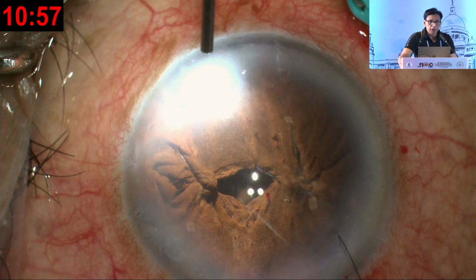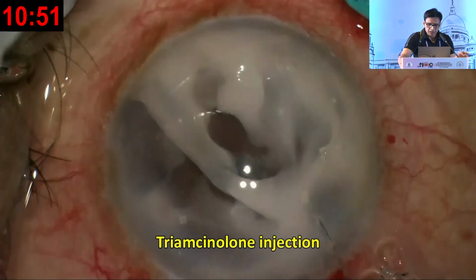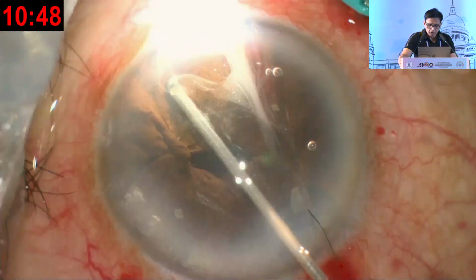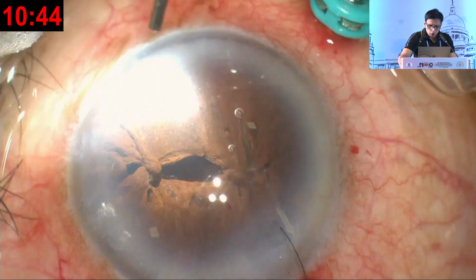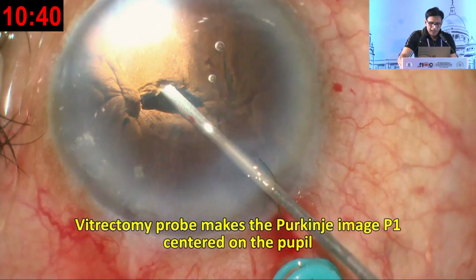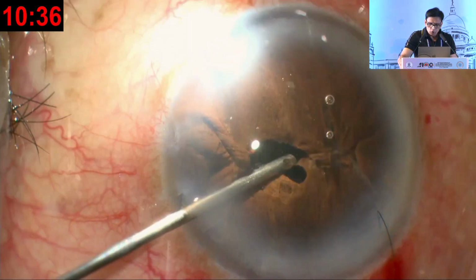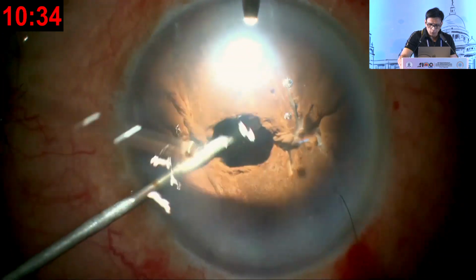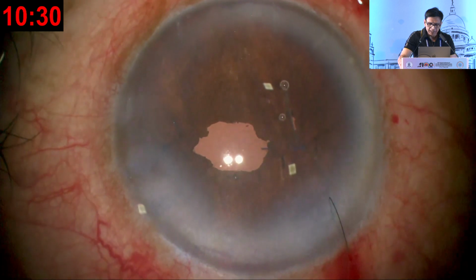Now an important issue at this stage is to check your Purkinje image. Look at the Purkinje image. I'm also checking if there's any vitreous present in the wound. And I'm going to clear up all that triamcinolone so that there's no vitreous present. Now I've got my Purkinje image there. I want to make the Purkinje image centered properly. So I'm just using the vitrectomy probe to make a good, nice pupil there.